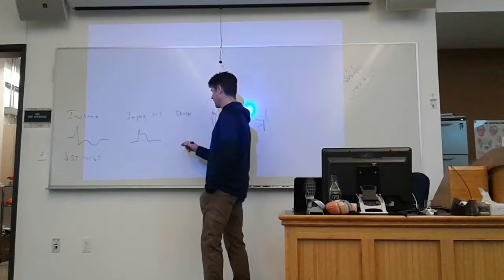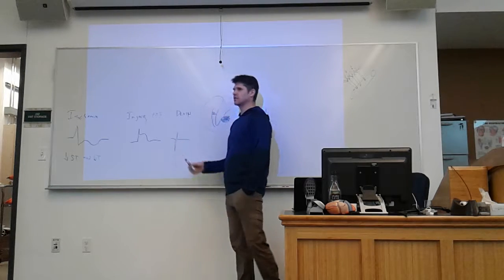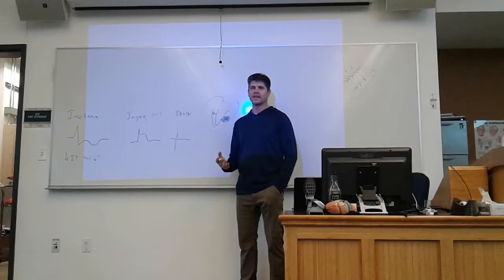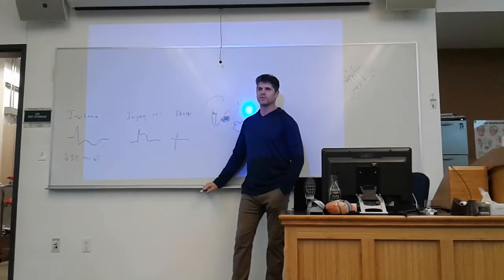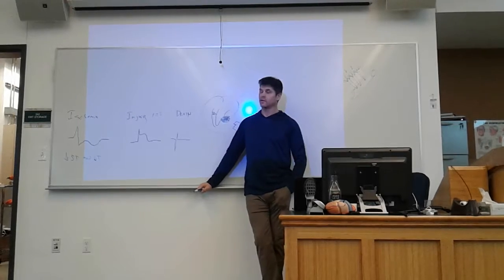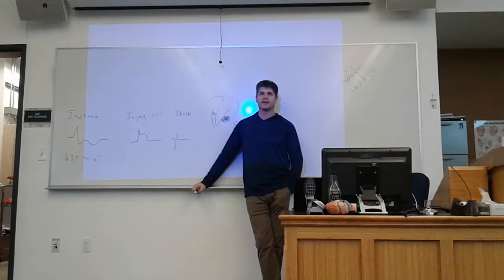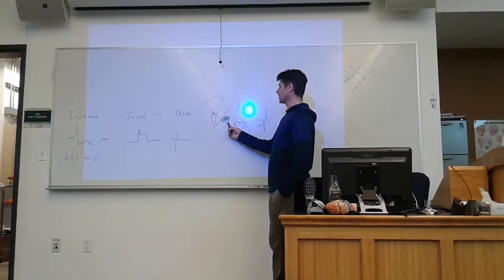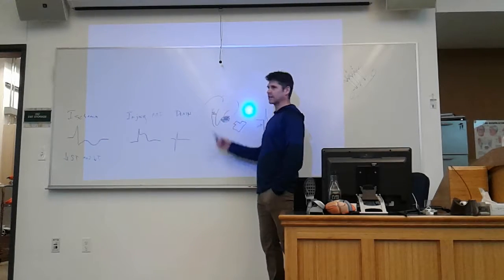And in death, we don't see any changes in the ST segment because there is no electrical activity in that dead tissue anymore. And instead we see a Q wave that develops because we're seeing the living tissue on the other side of our dead tissue. And the books will say this becomes a window to living tissue. And electrically speaking, that's exactly what it is.